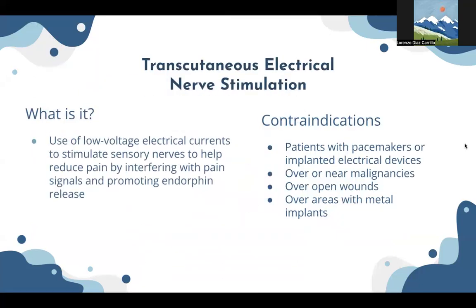And then here we have TENS, so transcutaneous electrical nerve stimulation. So what is it? It's the use of low voltage electrical currents to stimulate sensory nerves to help reduce pain by interfering with pain signals and promoting endorphin release.